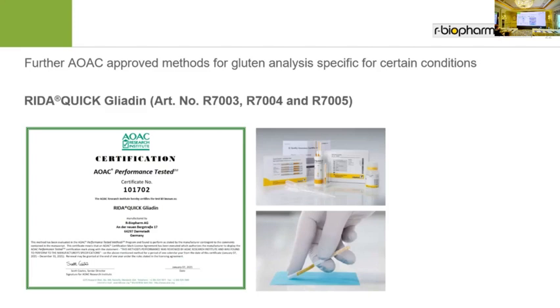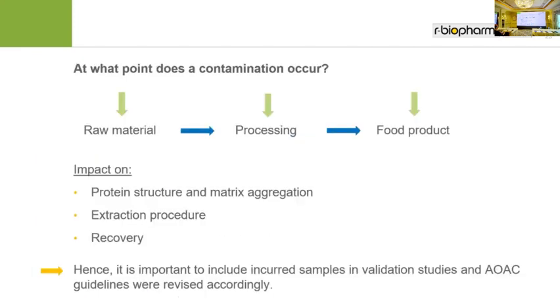So this means you all have to think, what do I have to test? At what point in the food preparation am I testing? Do I test raw materials?